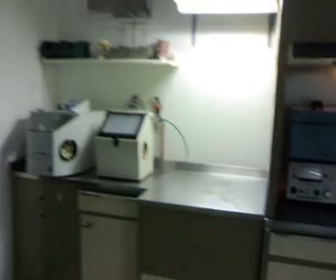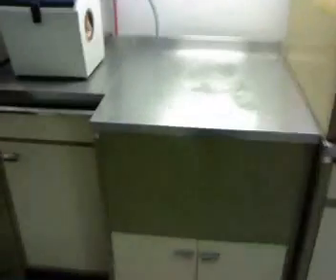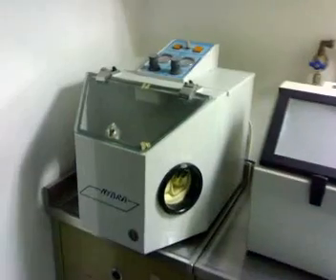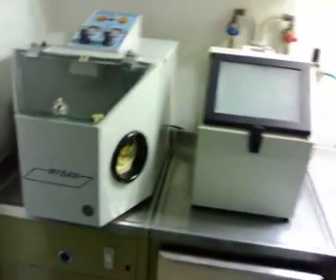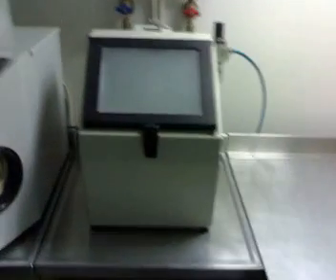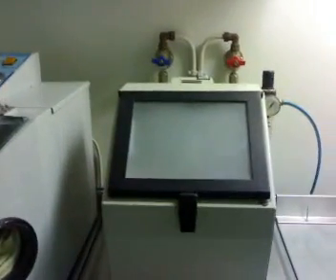We have two ovens in the soldering machine, and there's a suction system that goes up through the roof. We also have, in case of emergency and for small framework or broken parts, a smaller casting machine.